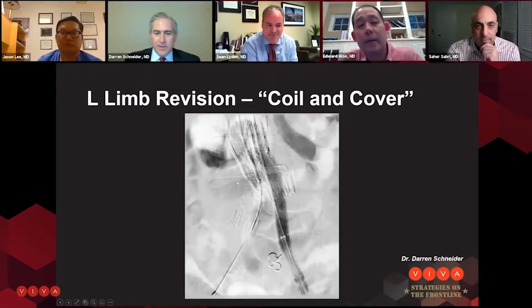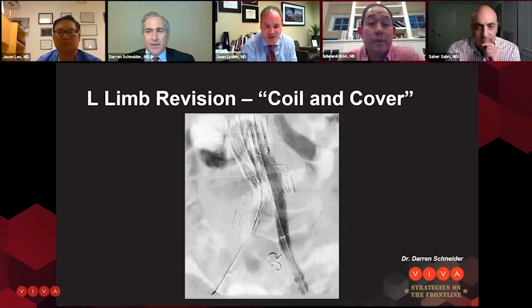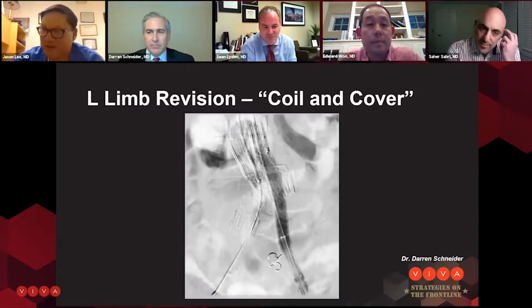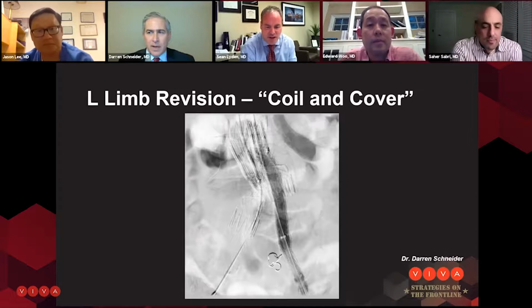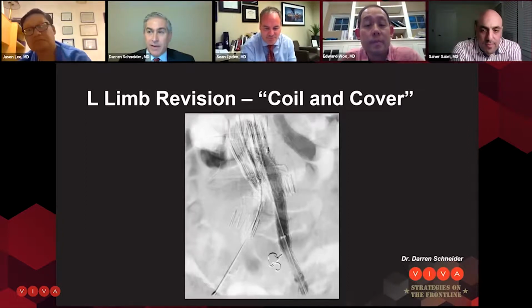And so now, are you guys worried? How often would you guys cover both hypogastrics in a setting like this? Would you ever? I would try very hard not to sacrifice both. Yeah, much older patient that might still be leaking retrograde. I guess you could stage, maybe 2 weeks apart, just out of some belief that maybe staging it could help. But in this patient, 65 or whatever, I think you have to keep one. You have to keep one going. Yeah, I think this guy's 65. He actually still works.